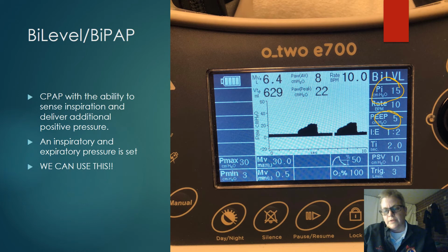I've been playing with these modes, cleaning the circuits and masks off, putting it on myself, and going between CPAP and bilevel. And for me, the bilevel is a little bit more comfortable, but I can tolerate the CPAP just fine, and the bilevel as well.